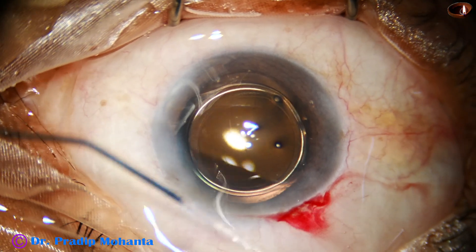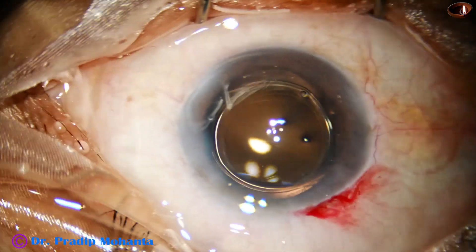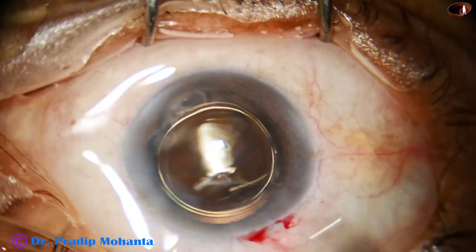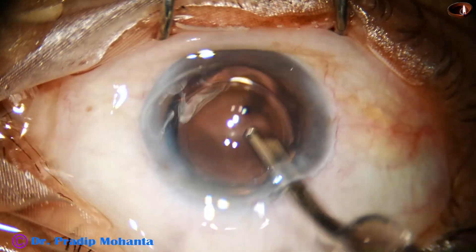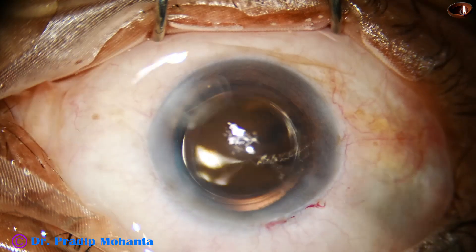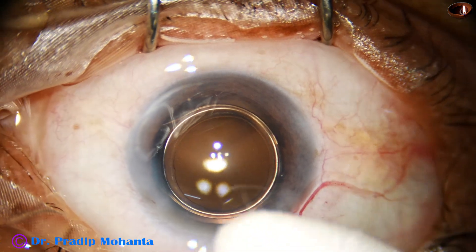The side port is closed by corneal stromal hydration. This is the final lavage of the anterior chamber. The anterior chamber is nicely formed, the integrity of the wound is confirmed, and the case is concluded.